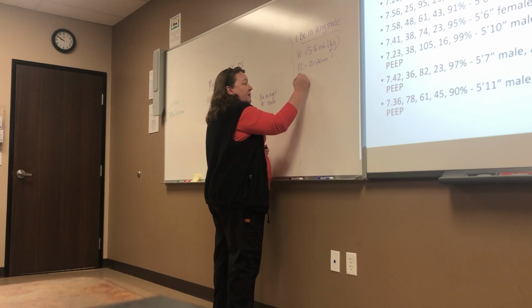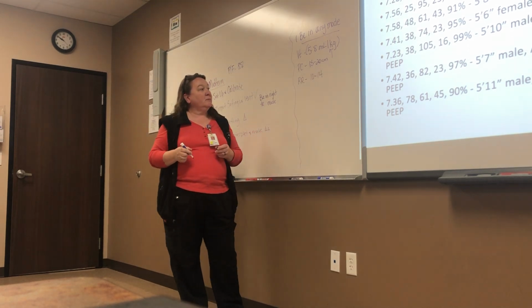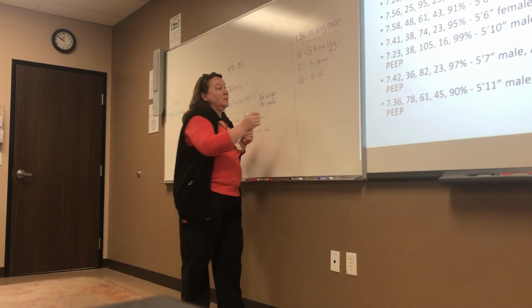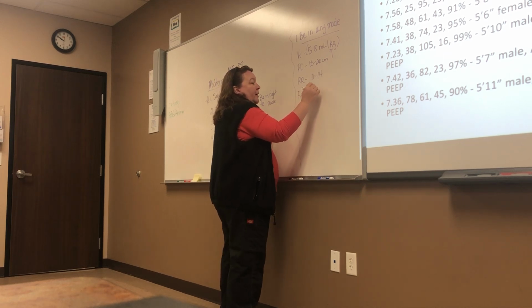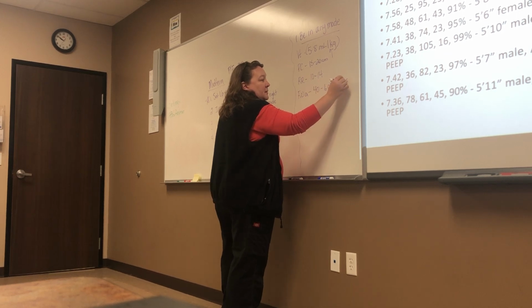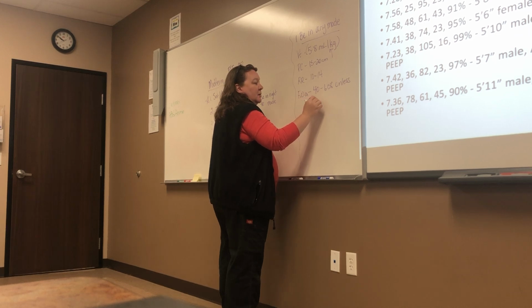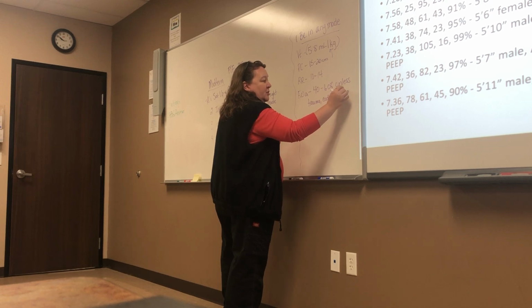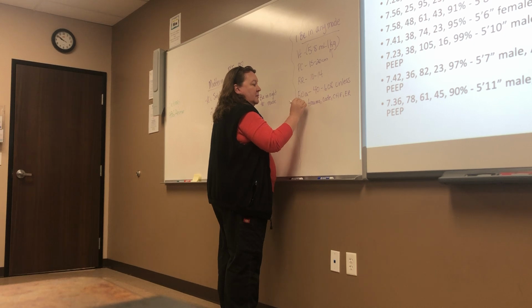Then your respiratory rate, 10 to 14. FiO2 is going to be 40 to 60%, unless they're like a trauma, code, CHF, like a patient in your ER. Then they're going to get 100%.